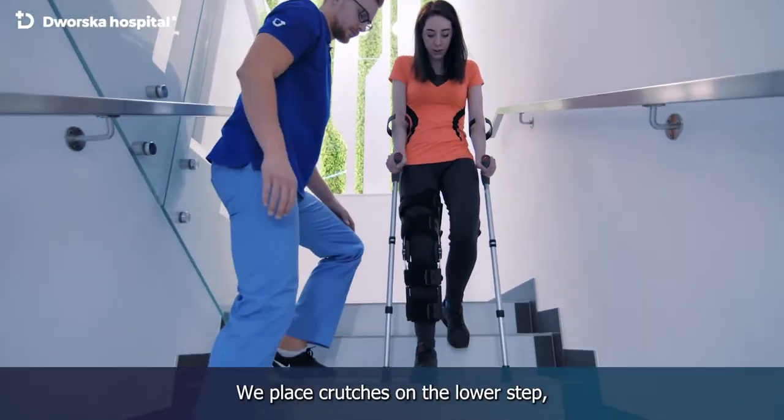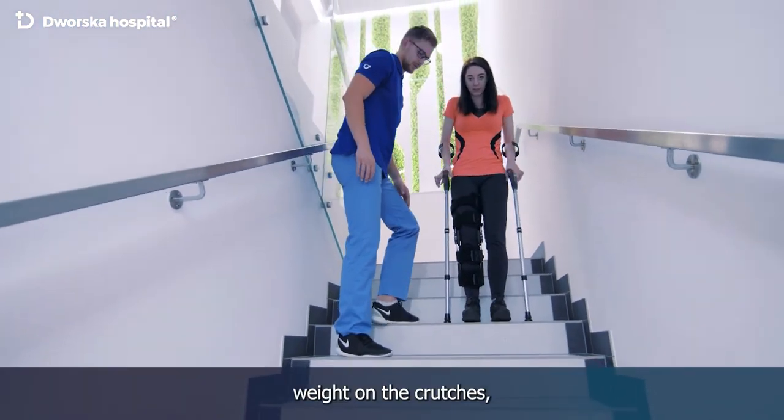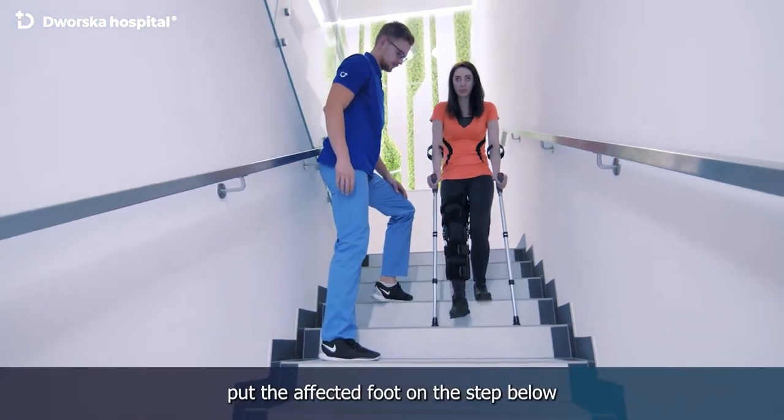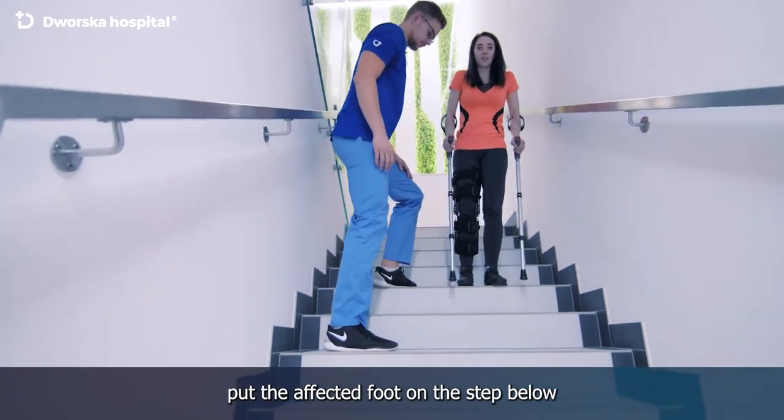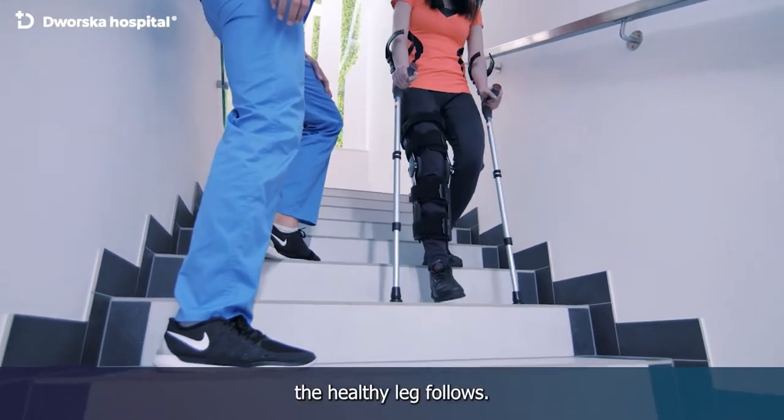Going down the stairs: we place crutches on the lower step, then slowly transfer the body's weight on the crutches. Carefully put the affected foot on the step below, leaning on the crutches. Lastly, the healthy leg follows.